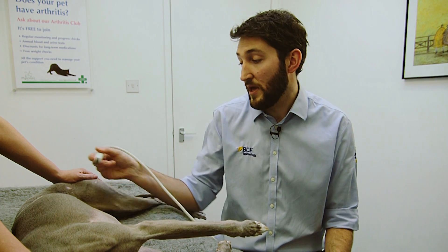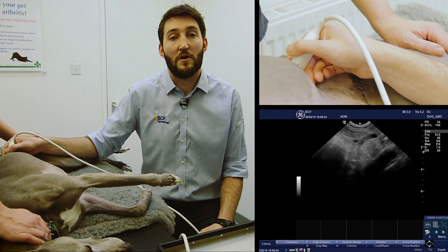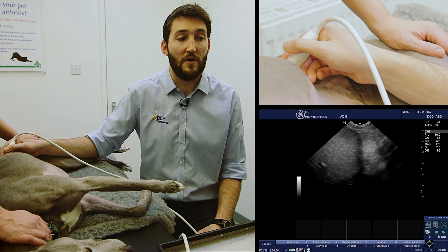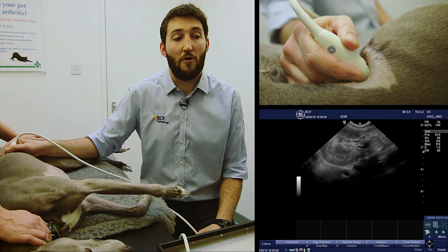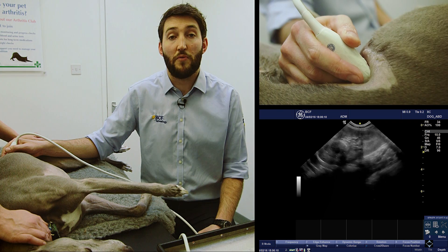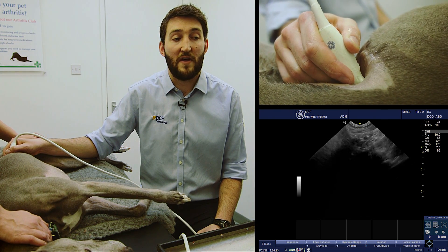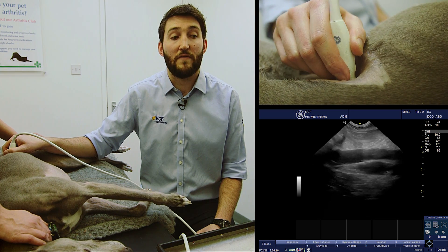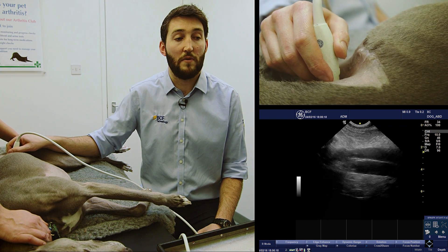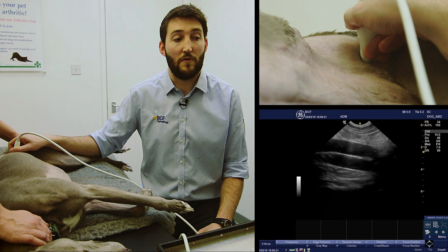To find the medial iliac lymph nodes, we're going to start where we started before to find our aorta and vena cava. So we find our left kidney, fan up off the dorsal border of the left kidney, and then fan back until we find the aorta and vena cava. We get those on the screen and follow them all the way caudally to the bifurcation, as we did before.